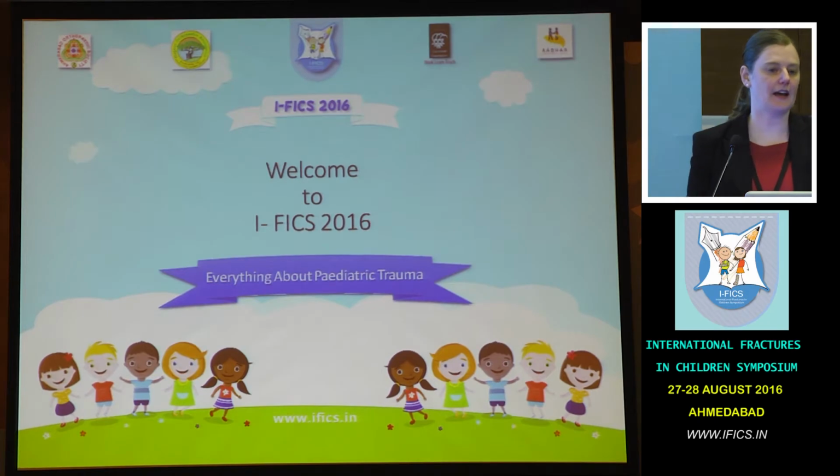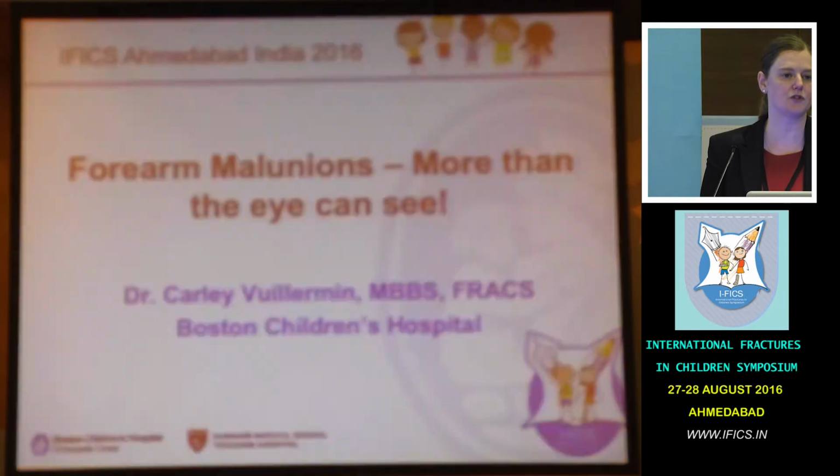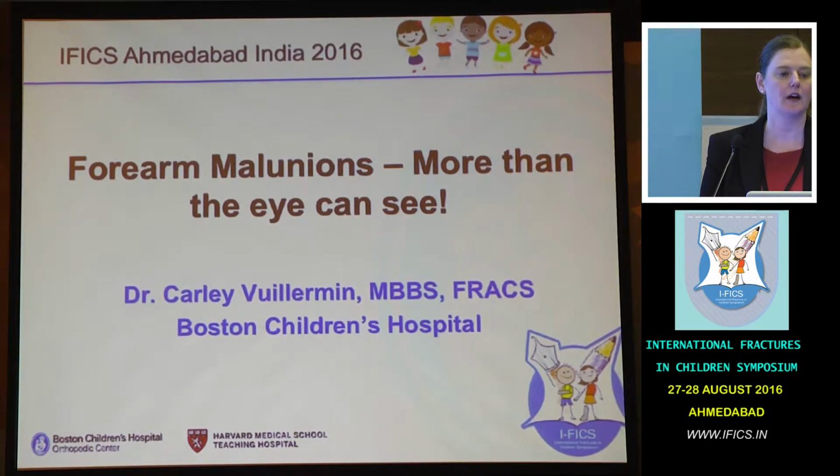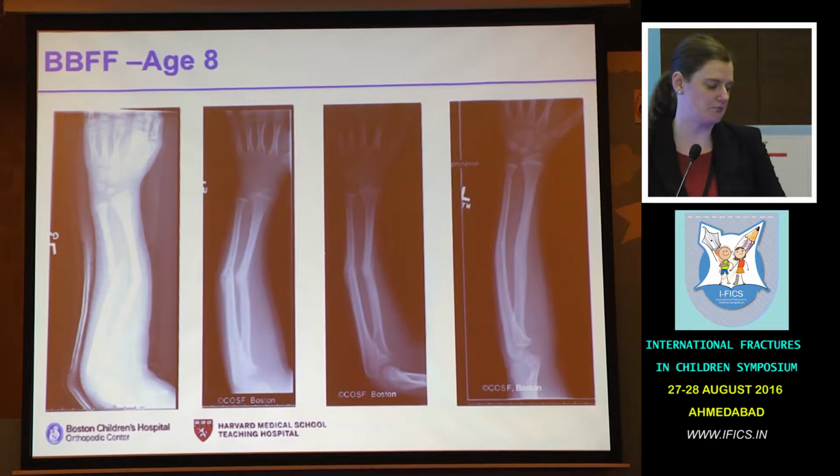So this is a technology that I've been using for about a year now, utilizing 3D CT scanning imaging and then computer-generated osteotomies and then customized jigs for the patients to perform forearm osteotomies. So this is a patient of mine.